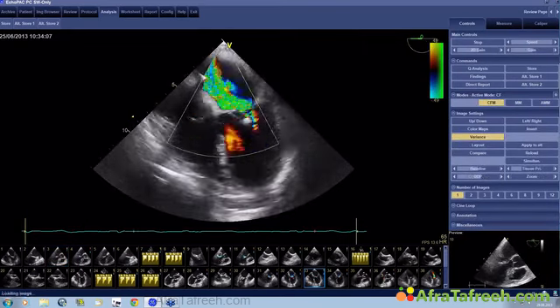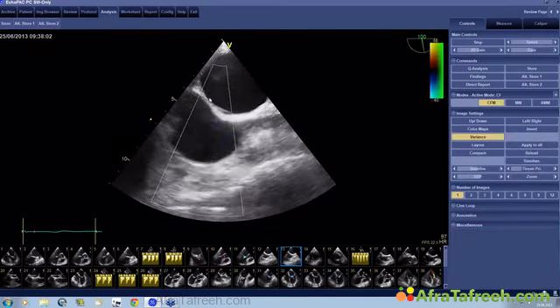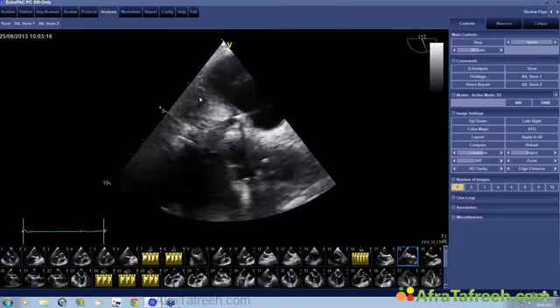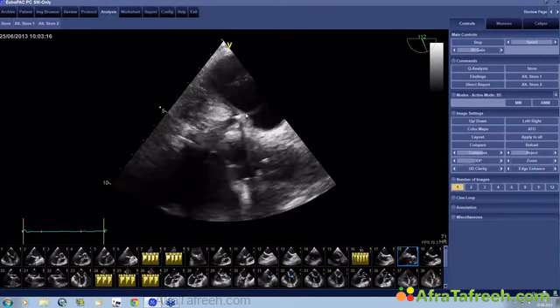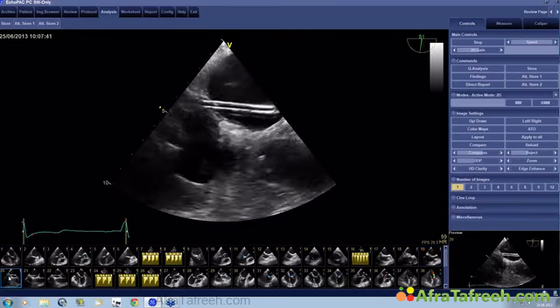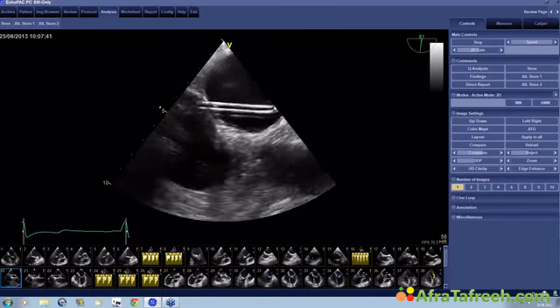And then we went on and performed the typical transeptal puncture. You try to find the right spot to go through there. Then you put the needle through. Here you see the interatrial septum. This is the secundum part. This thin part here is the primum septum. There is the needle, you see it right here. And then you poke it through and you see the tenting. And if you're lucky, you can see all of a sudden this tenting pop, and the needle going right through the interatrial septum. And then you put the introducer through the interatrial septum.